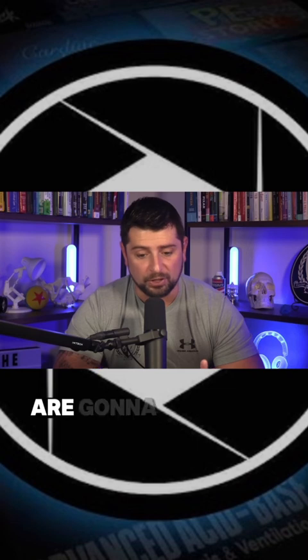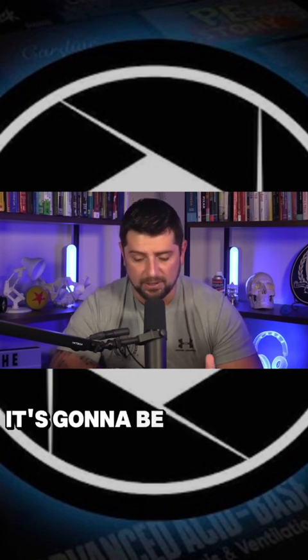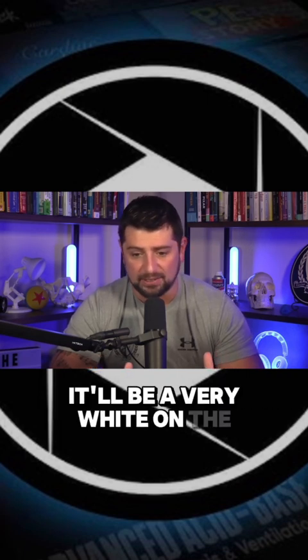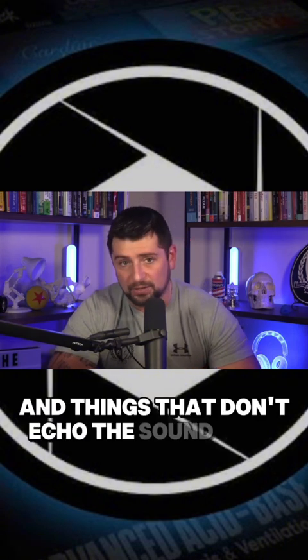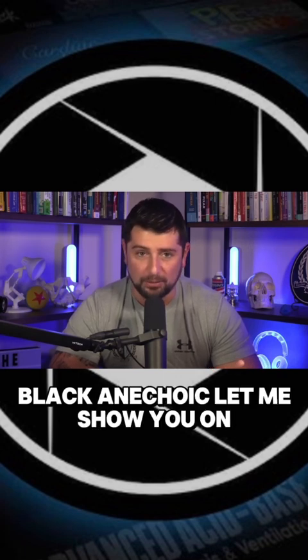Things that echo back the sound with a high amplitude are going to be known as hyperechoic. It's going to be very white on the grayscale value. And things that don't echo the sound back are going to be very dark, black, anechoic. Let me show you on my ultrasound device.